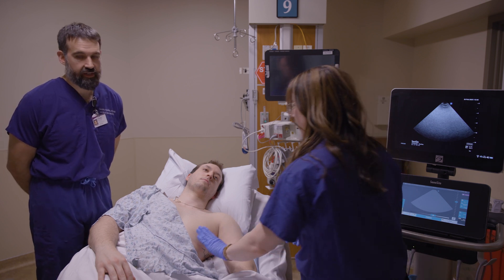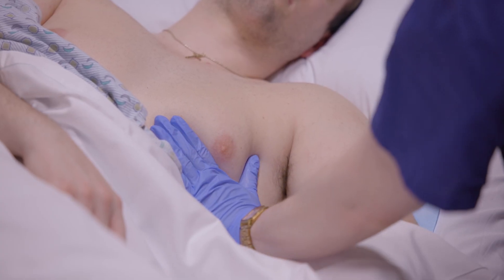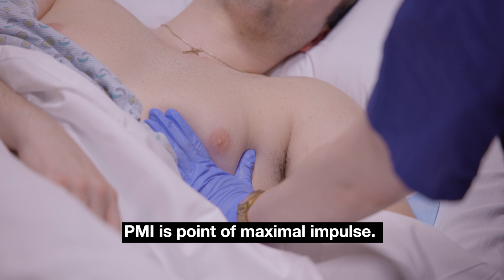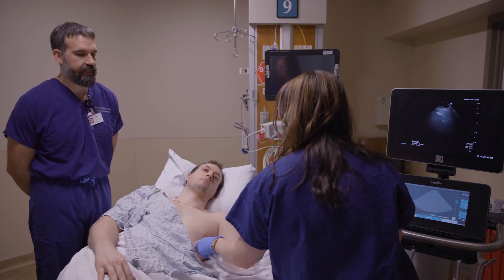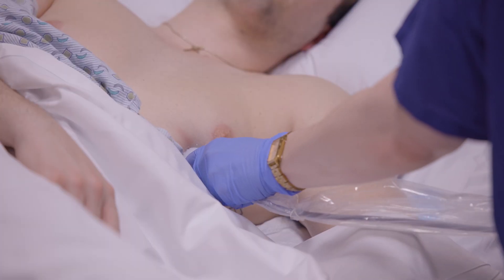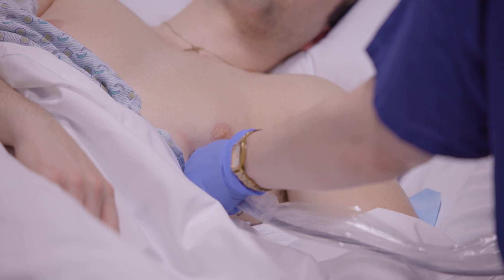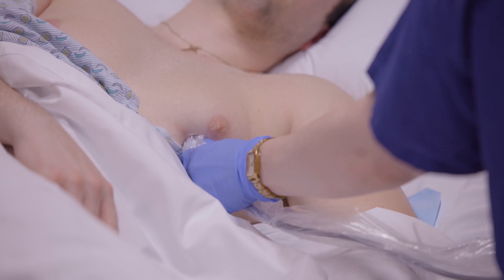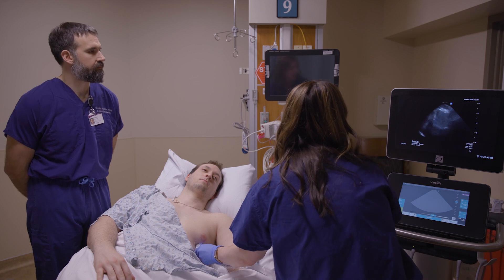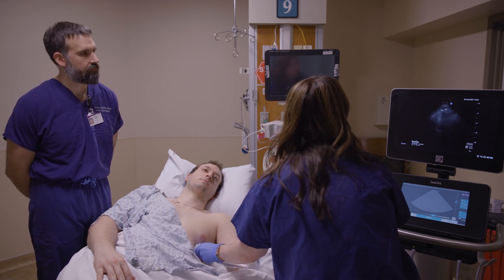Lauren is going to start by getting an apical four-chamber view of the heart. She does that by feeling for the PMI, and that tells her where to put the probe. It's important for the indicator marker to be pointed towards the patient's left. She's making small adjustments, rocking back and forth to get the septum as vertical as possible and to get all four chambers into view.